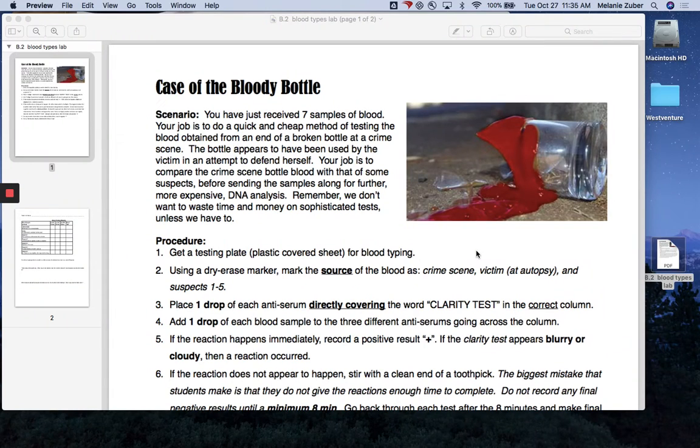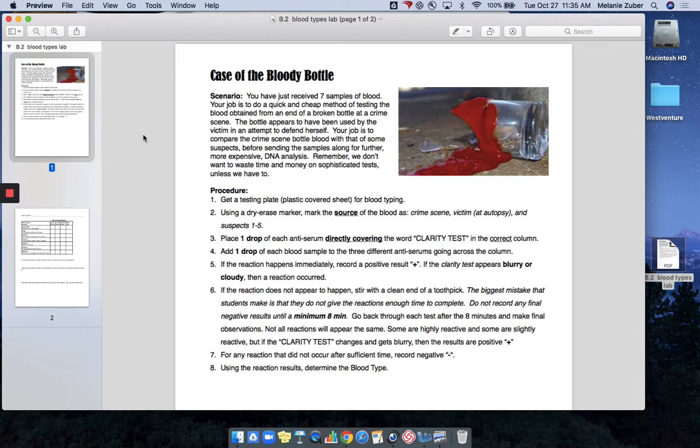Okay, hi everyone. I'm going to do a quick recording just to help you understand Monday's lab that we're going to be doing together, or it could be Tuesday if you attend forensics on B block. So what I want you to do is, I'm going to zoom this out. I want you to pause the video and read through the case that you're going to be trying to solve on Monday. And again, these are kind of like our tests.